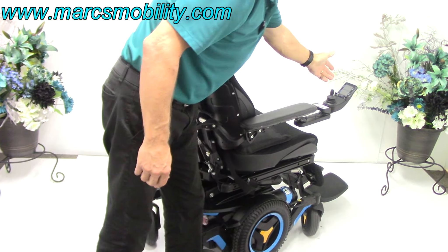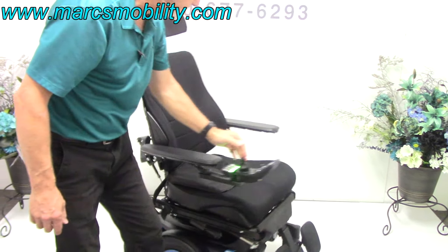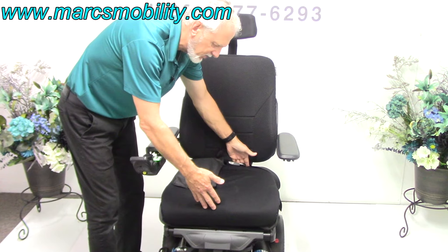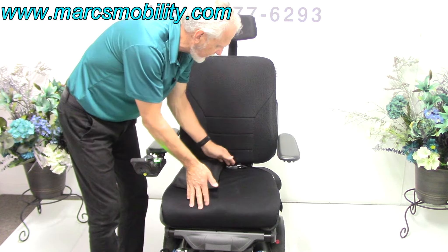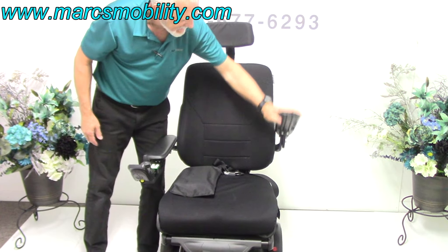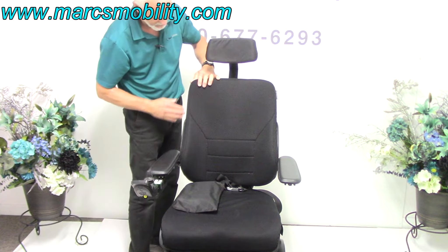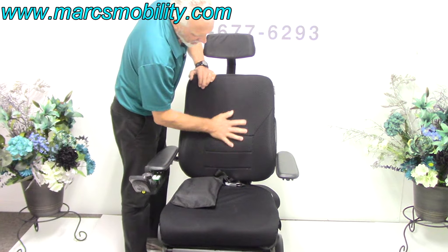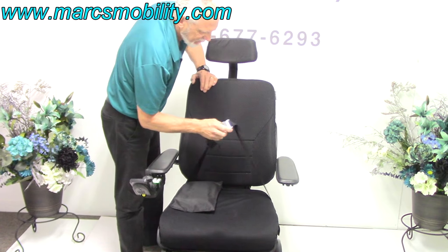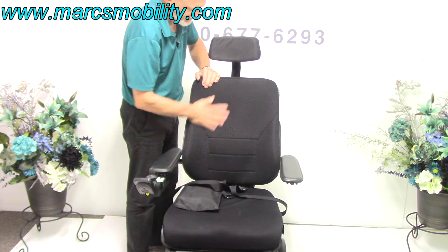The seat on this chair is 21 inches wide by 20 inches deep — it's a large seat. The arms flip up. This is a mesh back with some lumbar support that can be removed by going right behind the seat. You have a safety belt. Because it's a mesh back, you will not sweat — it's a custom mesh back, large at about 18 to 20 inches wide.